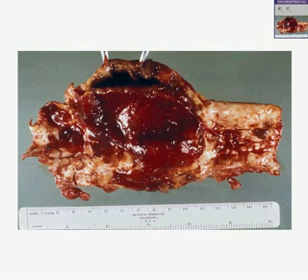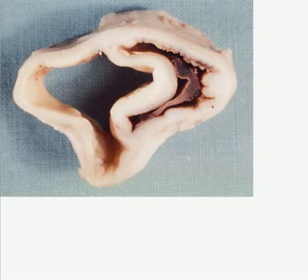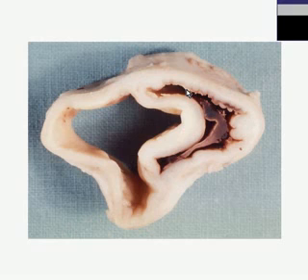Let's see if we can show something else here as well. Maybe we can, maybe we can't. Sure we can. Notice how there is a blood clot within the slit of this cut section of an artery. And offhand, you must have thought, well, does this artery have two lumens? Generally speaking, the larger lumen is probably the original lumen, especially if it's the wall that's thicker.